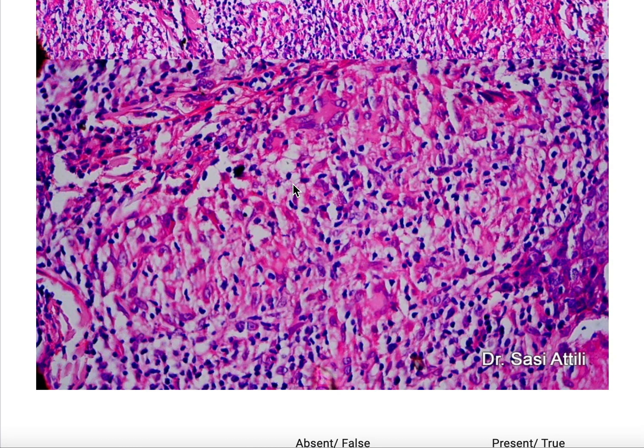In any granulomatous response, if the granuloma is big enough, the cytokine release may cause a bit of tissue necrosis in the center of the granuloma. This is described as fibrinoid in sarcoidosis and caseating in tuberculoid granulomas like in lupus vulgaris, or even tuberculoid Hansen's, though you may see that very rarely. But I've mentioned this before: the type of necrosis, whether caseating or fibrinoid, is very subjective. But if you mention the word caseating, you're usually referring to cutaneous TB. So I suggest you avoid the term unless you know what you're speaking about.